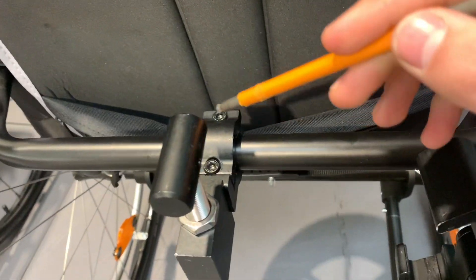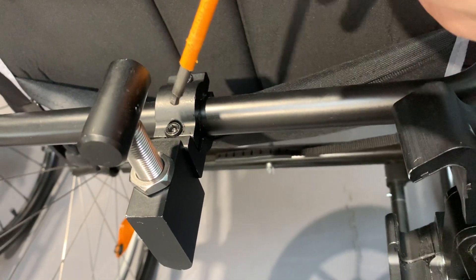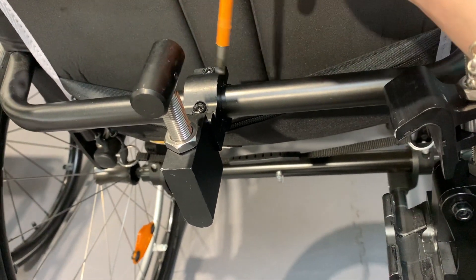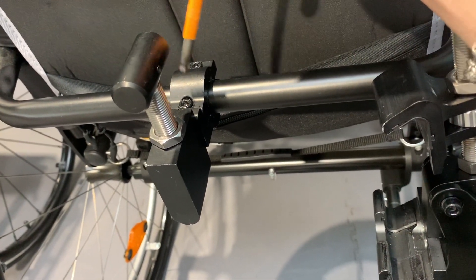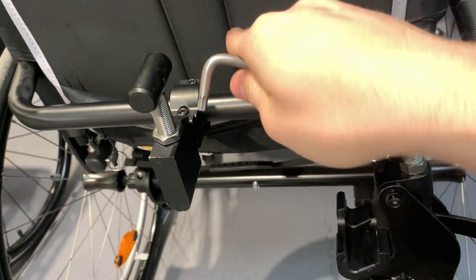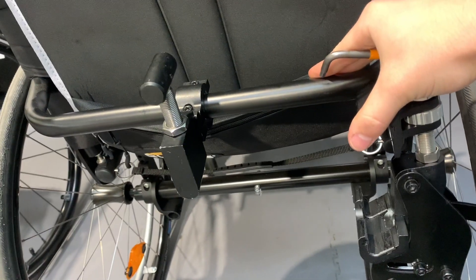What you're going to do is undo these completely when you get it, put it over your back bar, then start to tighten them gradually each side so one isn't going too deep and doesn't get it a bit off-centred.